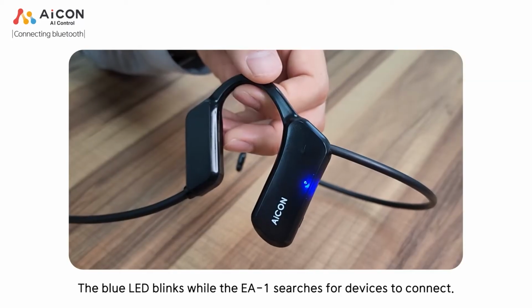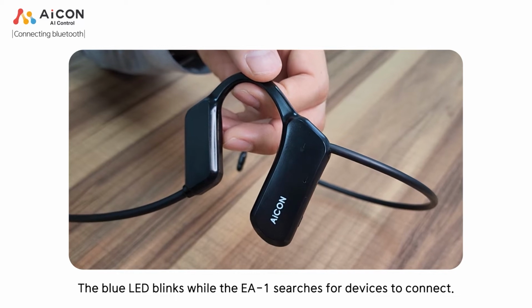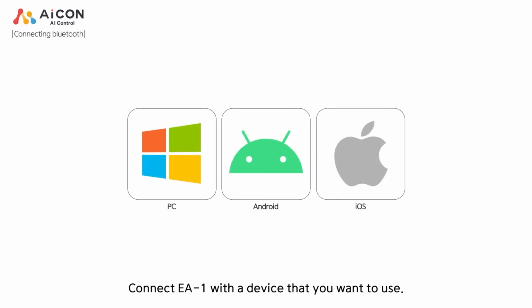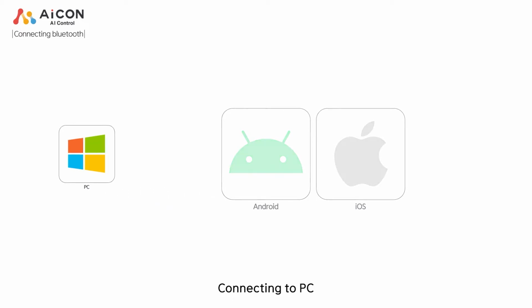The blue LED blinks while the EA-1 searches for devices to connect. Connect EA-1 with a device that you want to use.